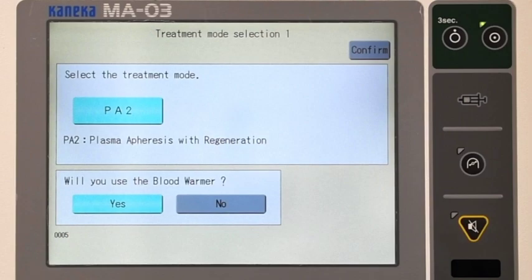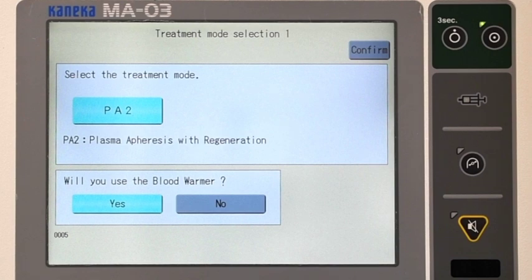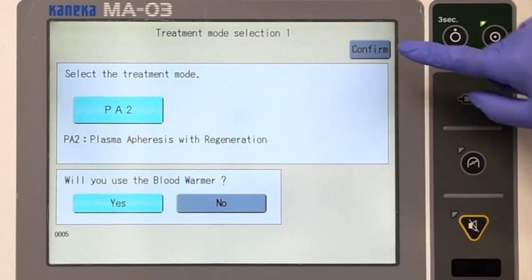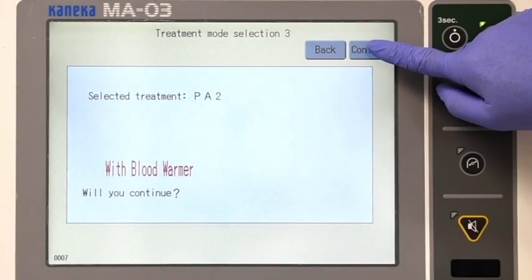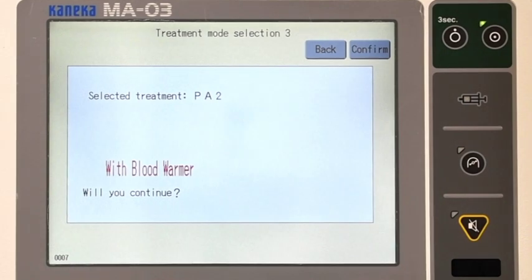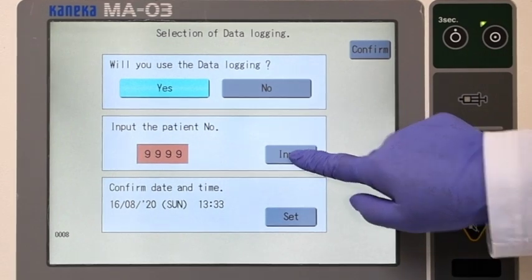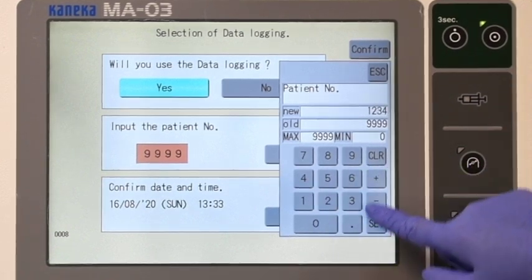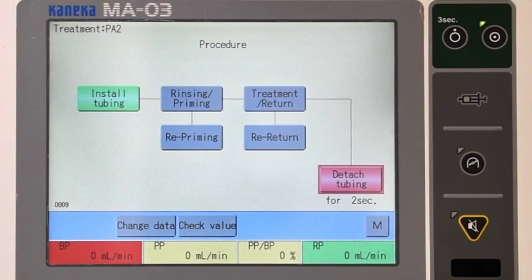Procedure. Select the treatment method. Ensure the treatment PA2 mode on the touch screen is lit green. Blood warmer is always used — make sure the yes key is lit. Press the confirm key, then press confirm again. Press input to enter the patient's identification number, press set to save, then press confirm. The procedure screen will appear. Touch install tubing highlighted in green — the valves will open.